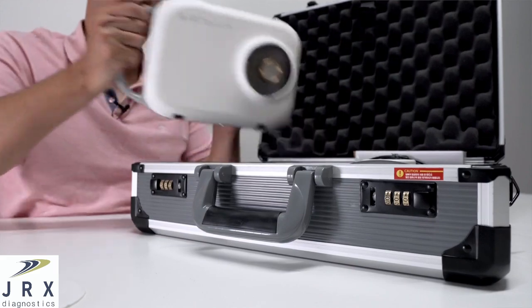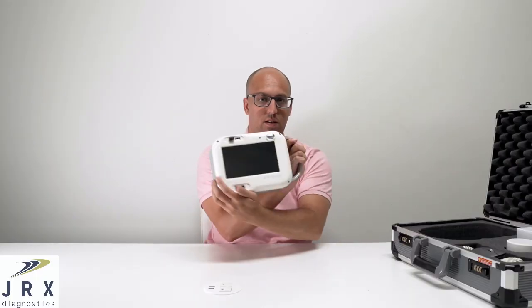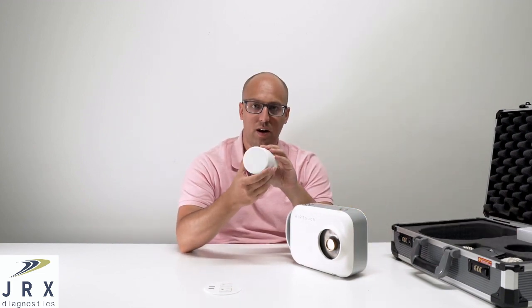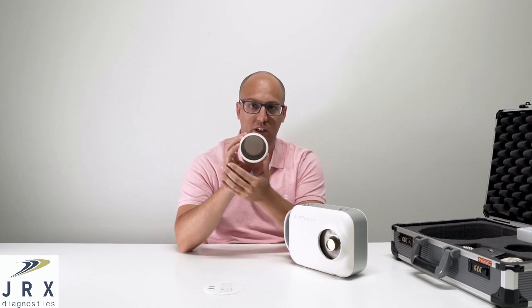I'll take the device out here. This is the portable x-ray system, and here is the lens, or the collimator. You can see it has some lead shielding on the inside.